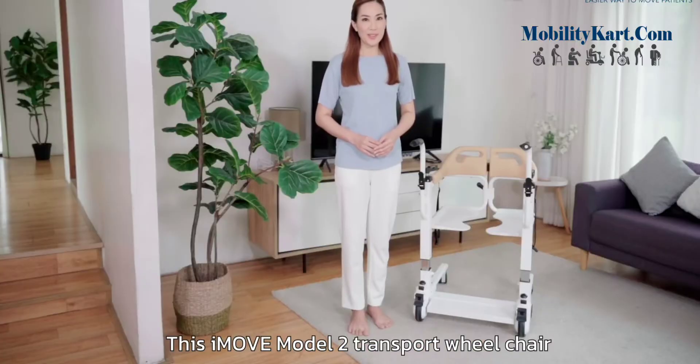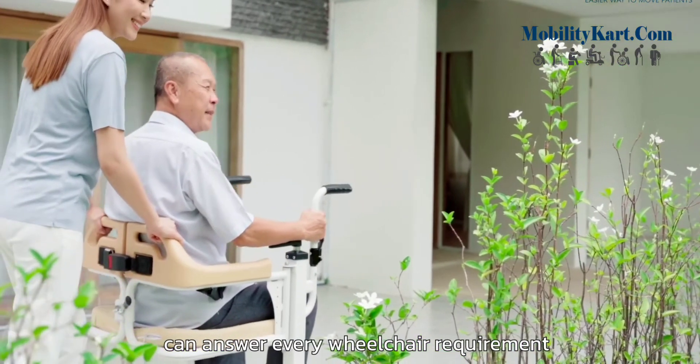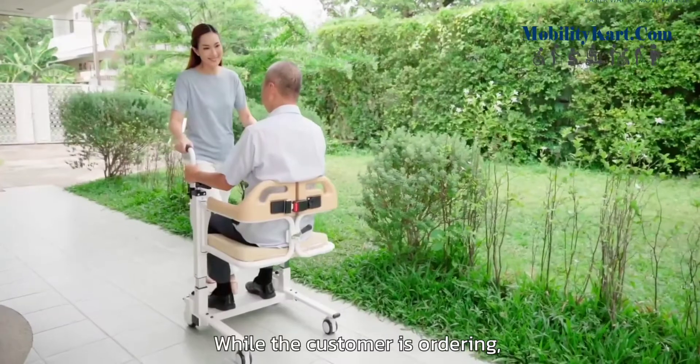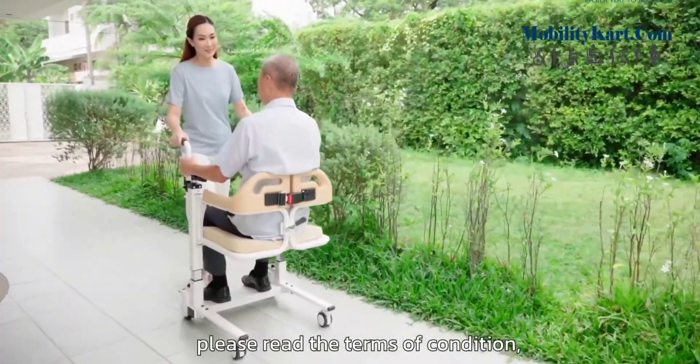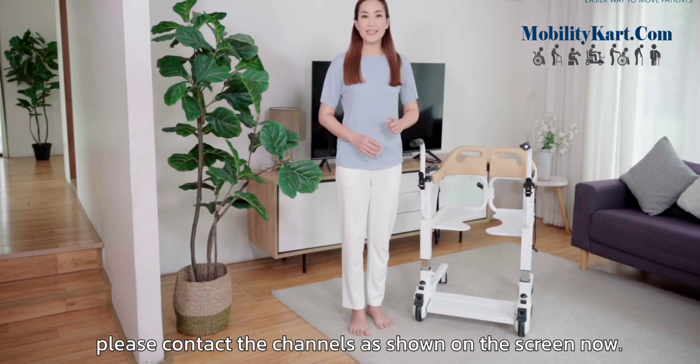This iMove Model 2 transport wheelchair can answer every wheelchair requirement, both for indoor use and outdoor use. While ordering, please read the terms and conditions, and if there is any further inquiry, please contact me.